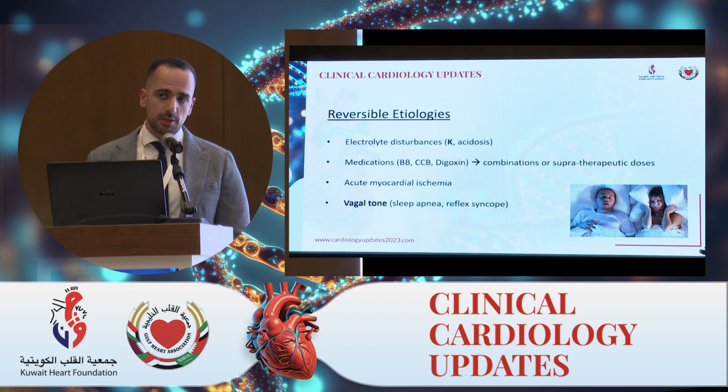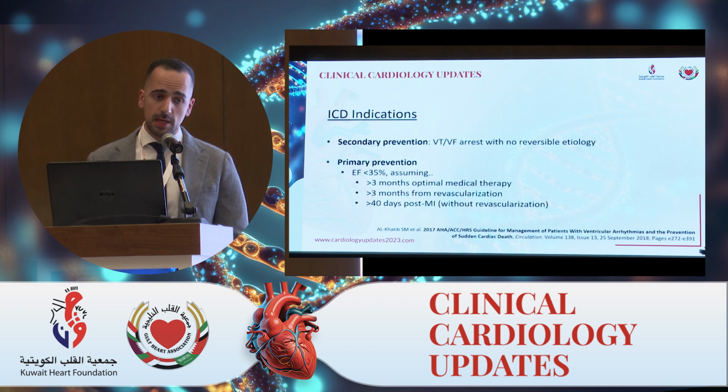For instance, a lot of patients you'll see come back with Holters, you'll see pauses at night or Wenckebach block, if not higher grade AV block. But if you can correlate these with sleep and the patient is asymptomatic, it is probably indicative of underlying sleep apnea.